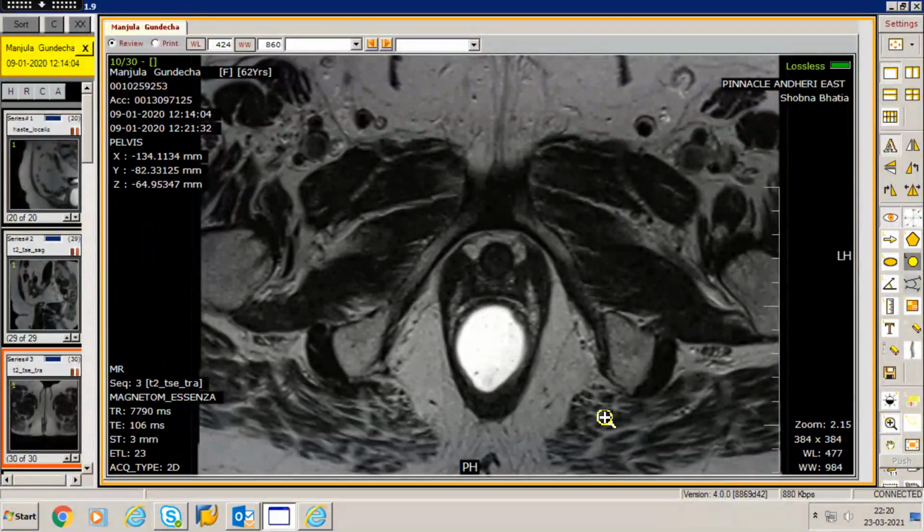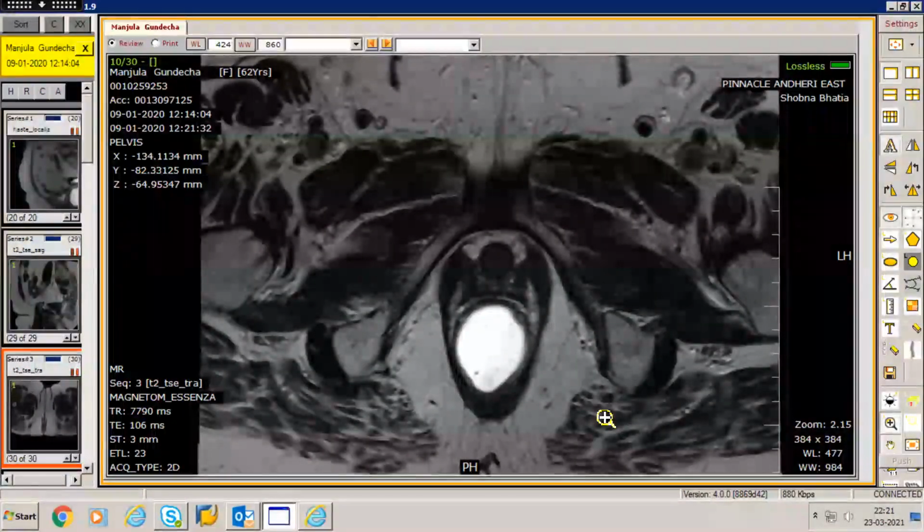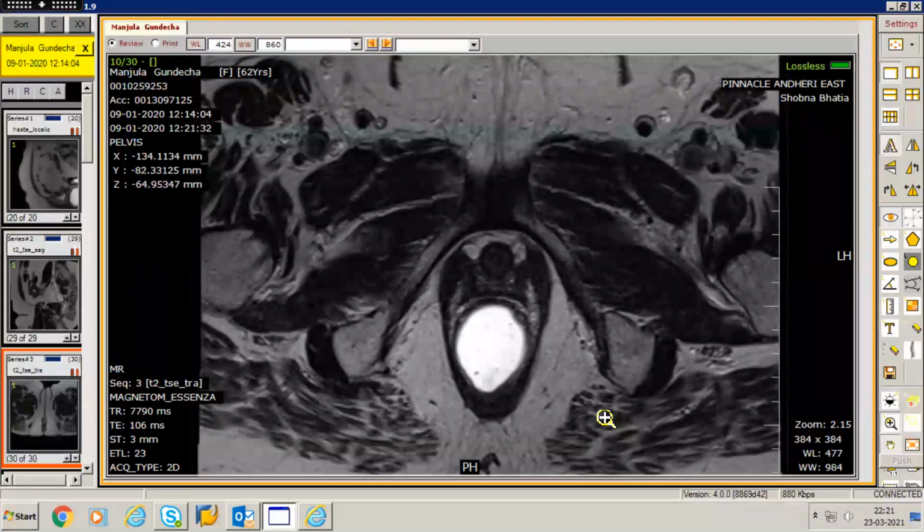Also, you can add certain additional measurements, such as the width of the hiatus, not only the anteroposterior extent of the hiatus, and also you can have certain angles, such as the iliococcygeus angle, and also the levator angle, which is an angle between the levator shelf and the PCL line itself. So there are three more additional angles which you can have in these patients, and distances. But most importantly, you have to understand the biology of defecation and how exactly it works. And based on that only, you'll be able to interpret it.